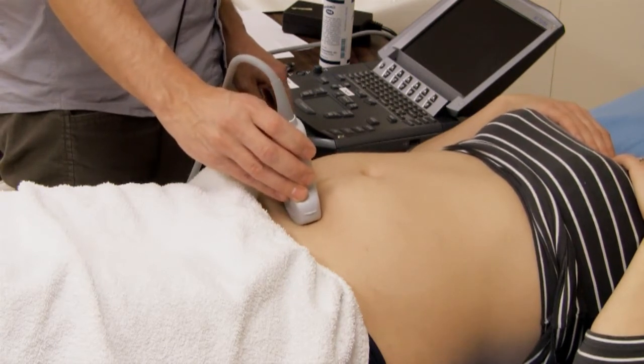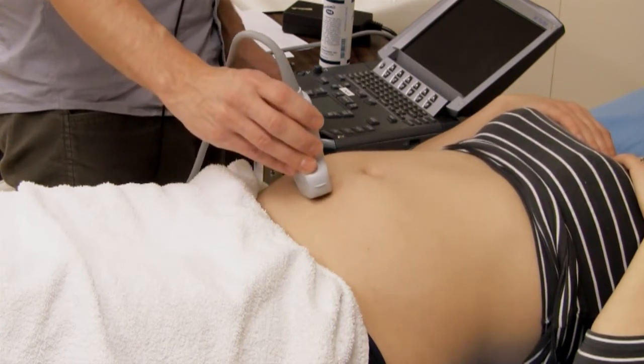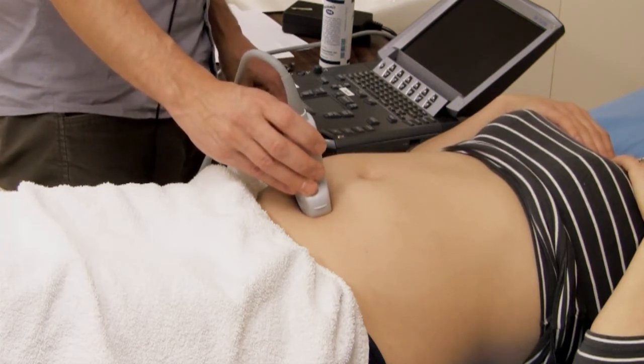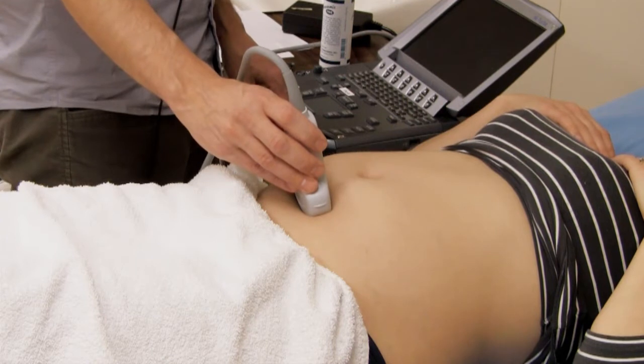Once the bladder is identified, slide cephalad into the gravid uterus. The next structure you should encounter is the fetal head. This will be ovoid and have bright echogenic walls.